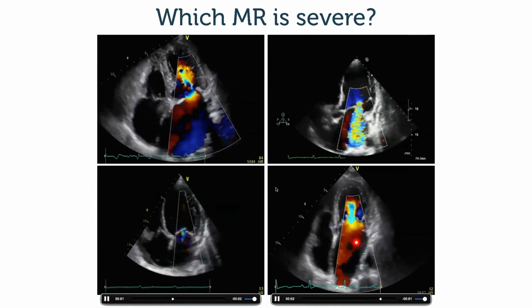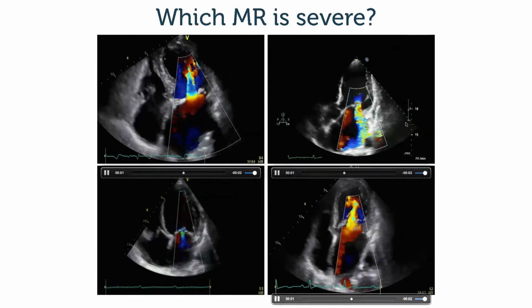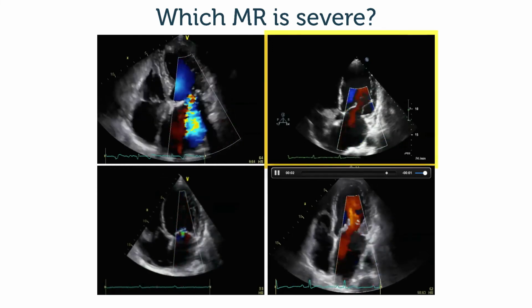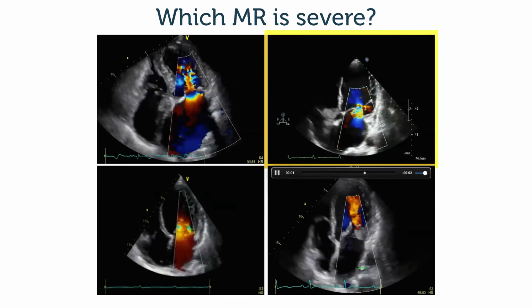As you can see, it really is crystal clear. This is the case with severe MR, with this really broad jet. See, it was easy. You make the diagnosis, I'm sure of it. Exactly, Anna. This is the teaching point we're trying to make. Echocardiography is not so difficult, and it's very rewarding, and it's a lot of fun. At least we had a lot of fun making this course.